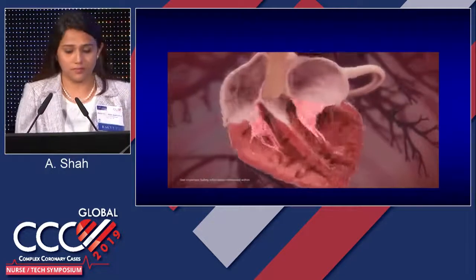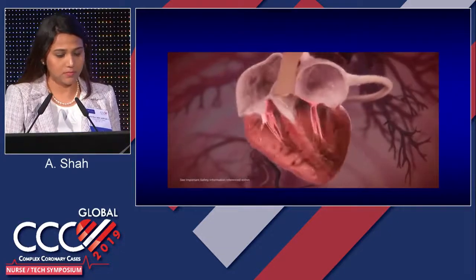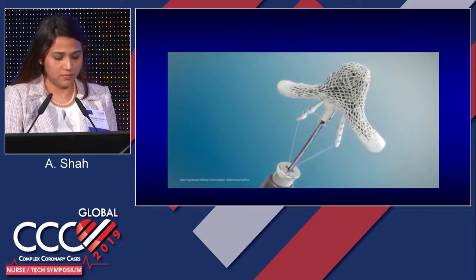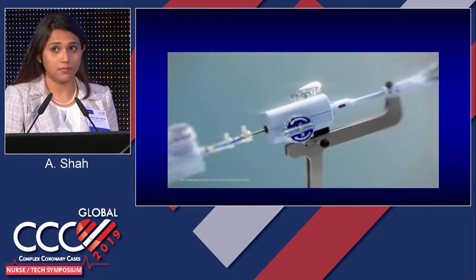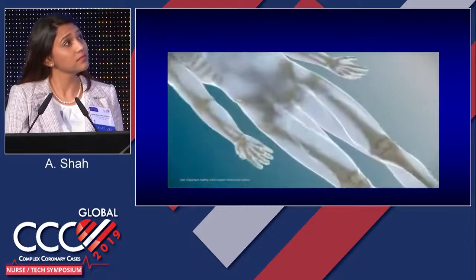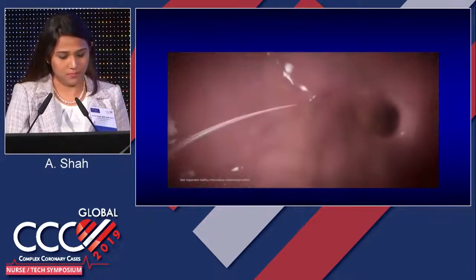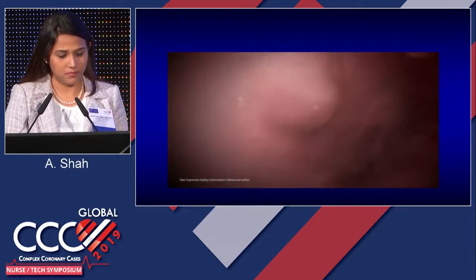MR is a progressive disease which, if left untreated, can initiate a series of events culminating in heart failure and death. Current guidelines recommend surgical mitral valve repair or replacement in severe MR patients. For MR patients for whom surgery is not an option, minimally invasive procedures are available. MitraClip is a unique, highly maneuverable transcatheter system for mitral valve repair. This procedure avoids cardiopulmonary bypass using minimally invasive venous approach and transseptal puncture to gain access to the left atrium.